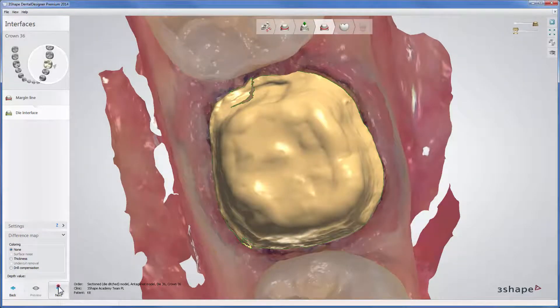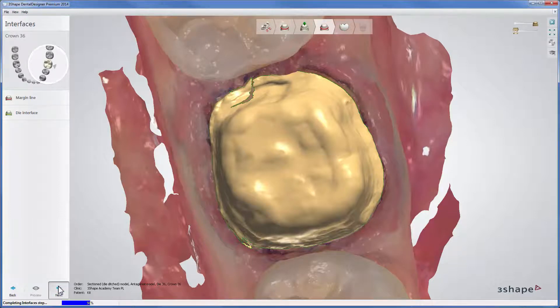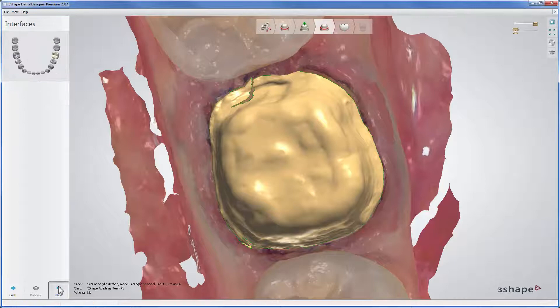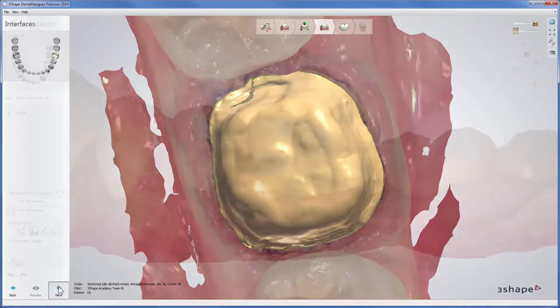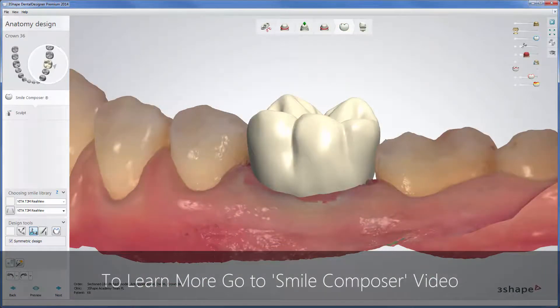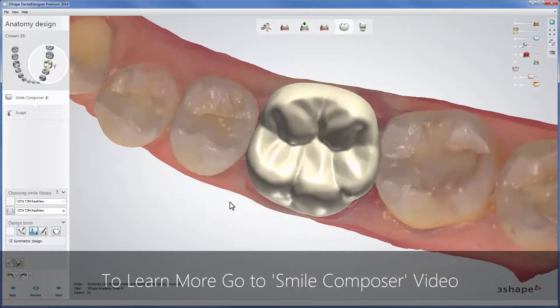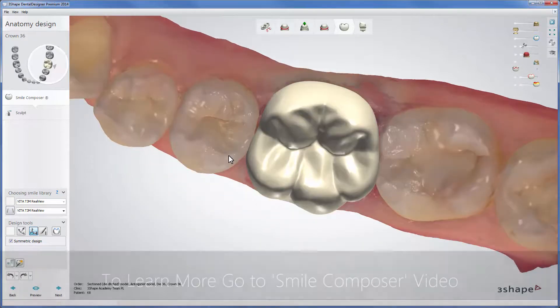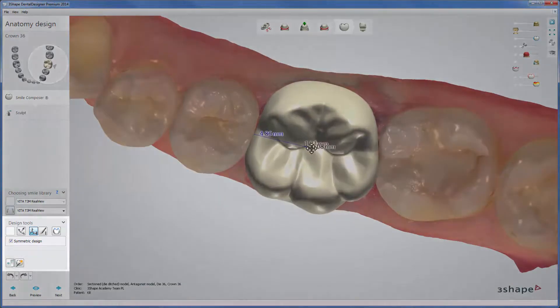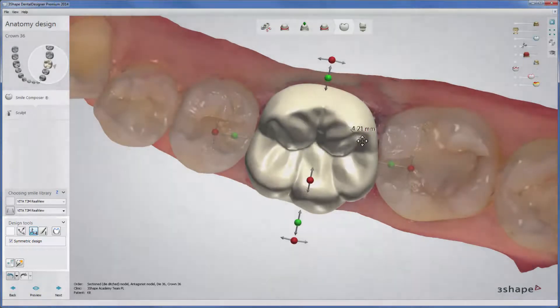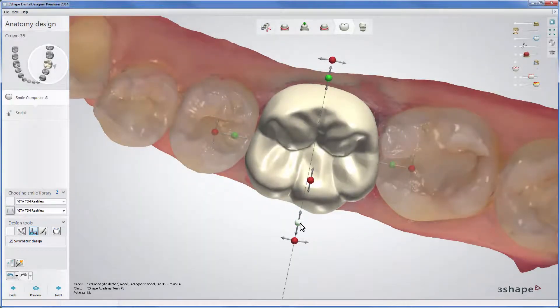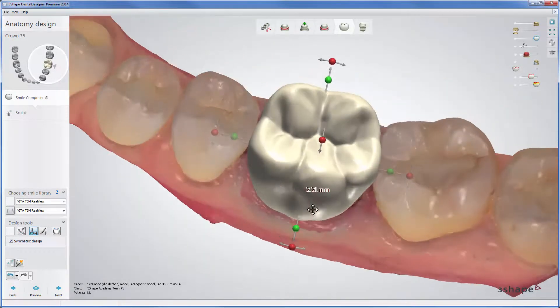Now click Next to proceed to the anatomy design step, where Dental Designer automatically places a crown. Smile Composer allows you to specify the Smile Library to shape your crown. Using the design tools, you can do all necessary adjustments to your design.